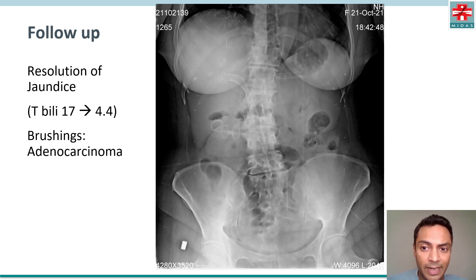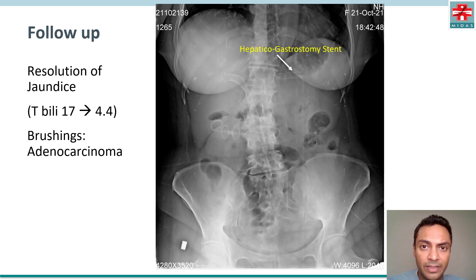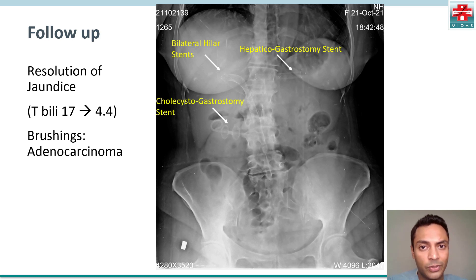Her brushings were positive for cholangiocarcinoma and she was started on chemotherapy. What you see here is the hepatico-gastrostomy stent, the bilateral hilar stents, and the cholecystogastrostomy stent in this patient.